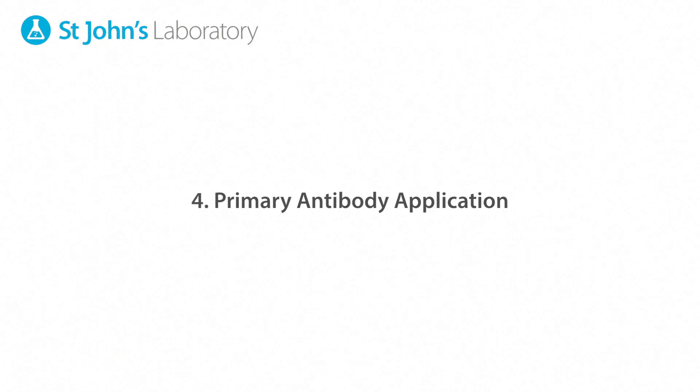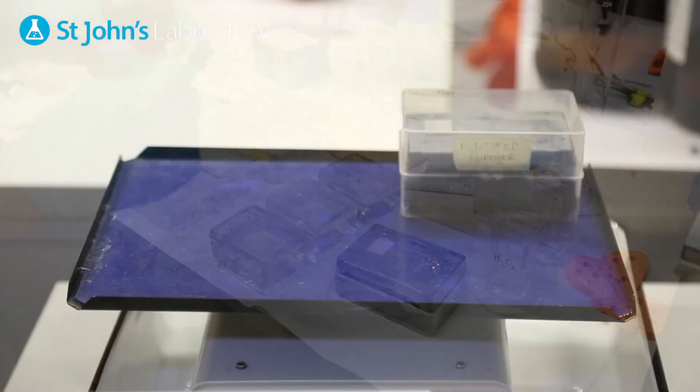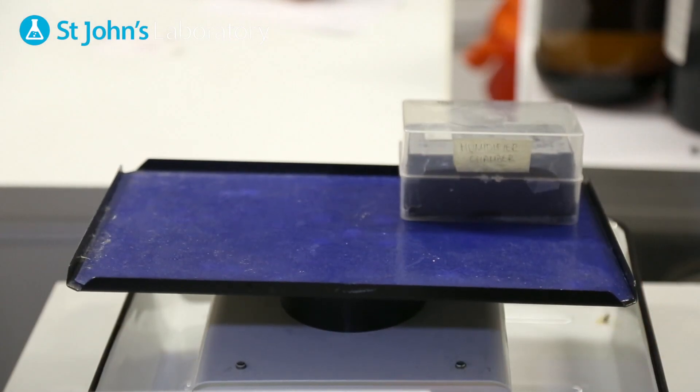Once the blocking process is complete, briefly wash the slide in PBS before applying the primary antibody, and leaving in a humidified chamber overnight.